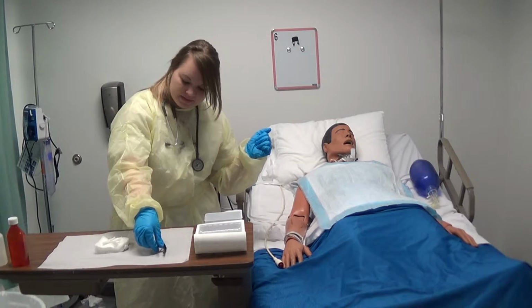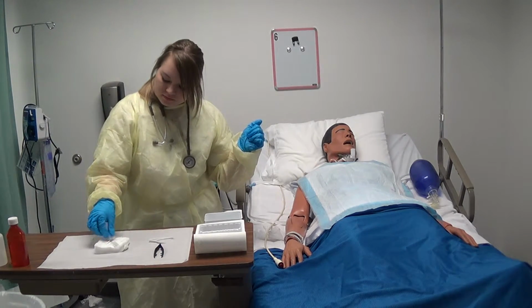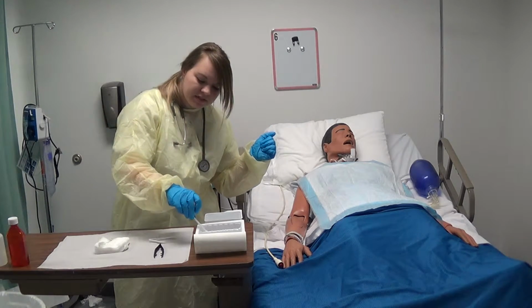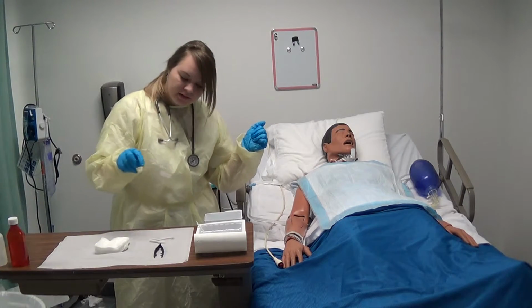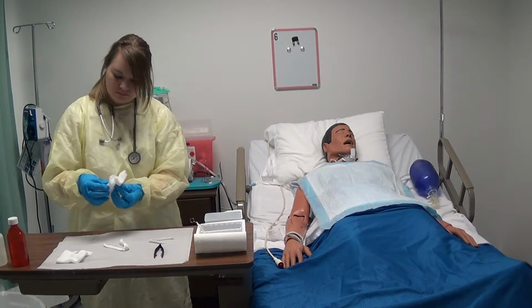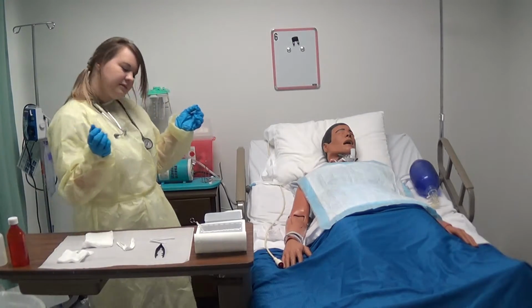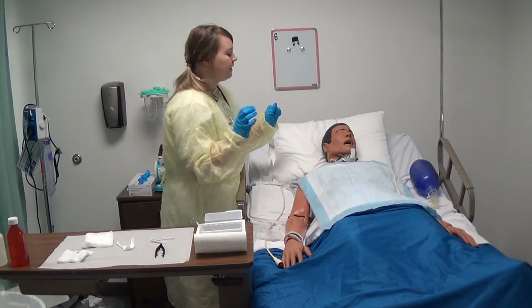I'm going to set up my sterile field a little more, organize it. I'm going to go ahead and place my Q-tips in some normal saline to clean. Now I'm ready to begin. This is my sterile hand, this is my non-sterile hand now.